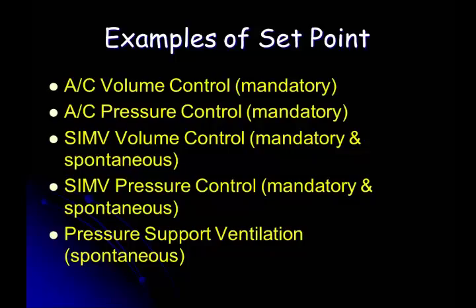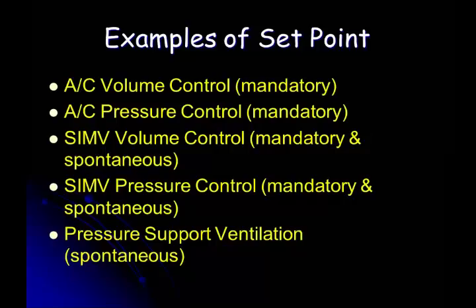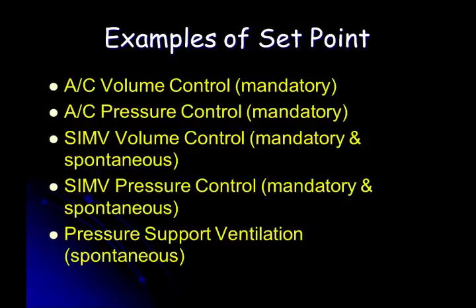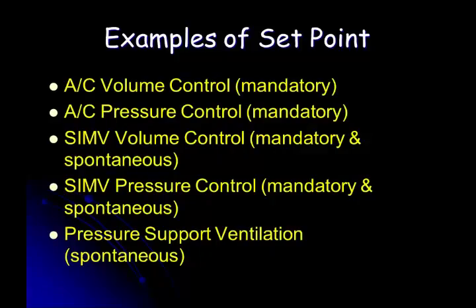When you say you have a fixed volume or a fixed pressure, I would think you'd want to just use volume. But if you would use the pressure, is that based on the patient's lung compliance? I just can't picture why you wouldn't use just volume. Why would you want to set the pressure only? She's got a great question.